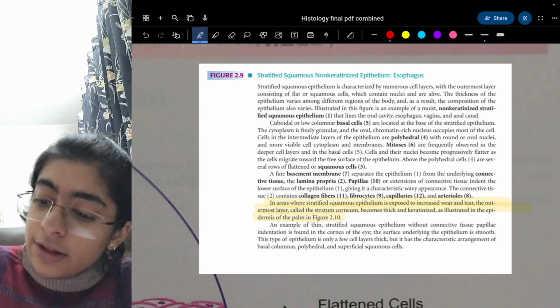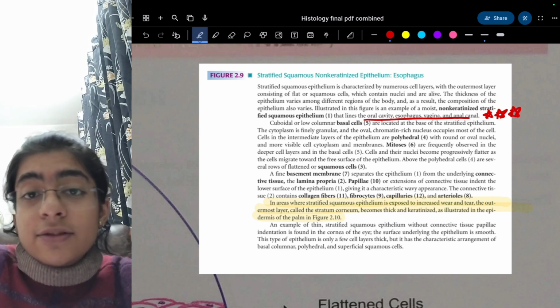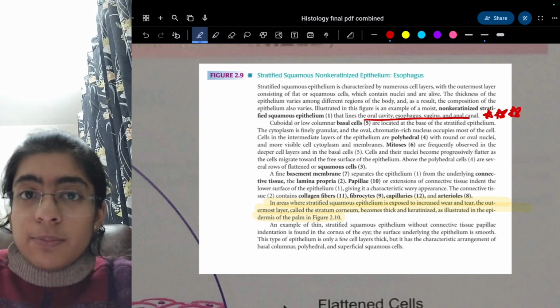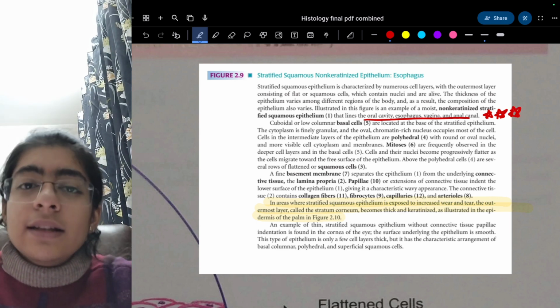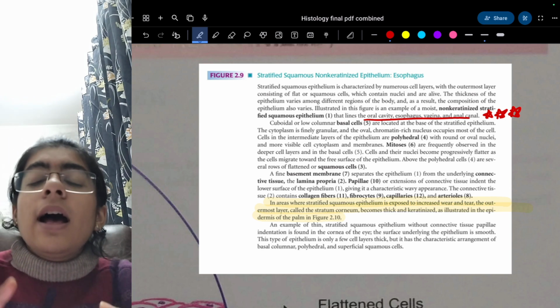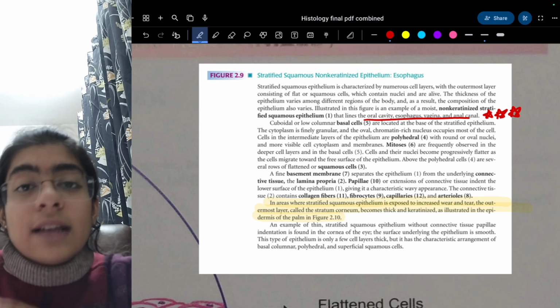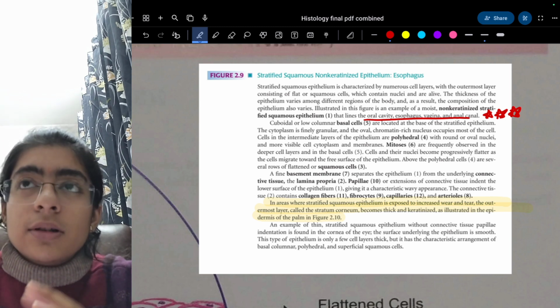Just to tell you, these examples are very important. Mark them 5-star, because in every example of the epithelium or any slide, these will be asked in your spotting where it is present, and also by the examiners in the vivas, the grand viva and everything.